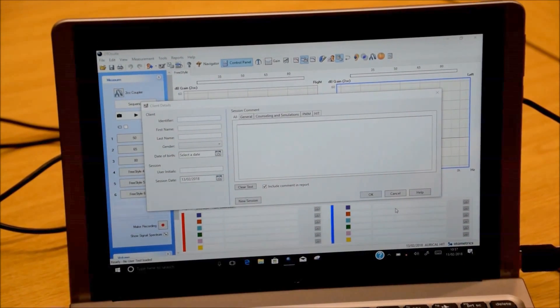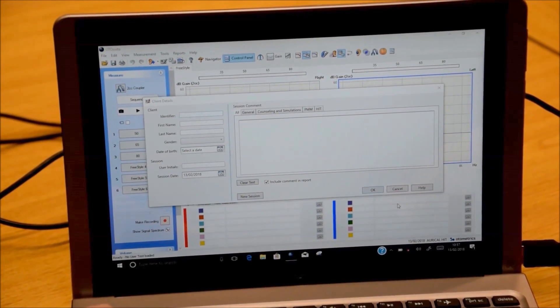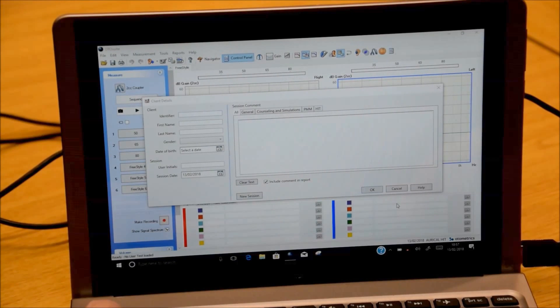The dialog box at the beginning is for information to go on reports, so we're going to leave that just for the moment.